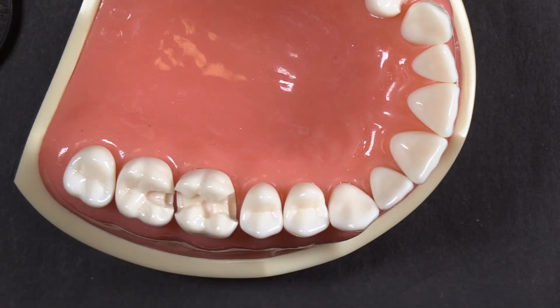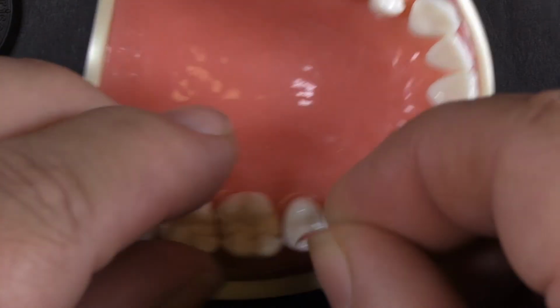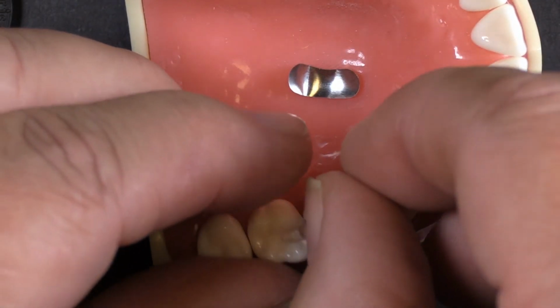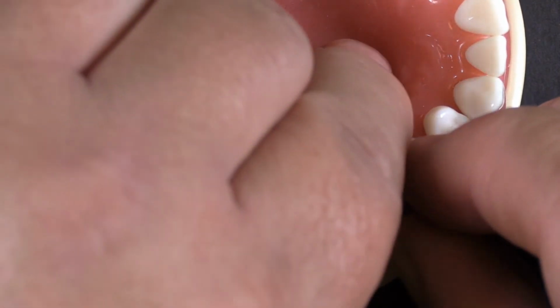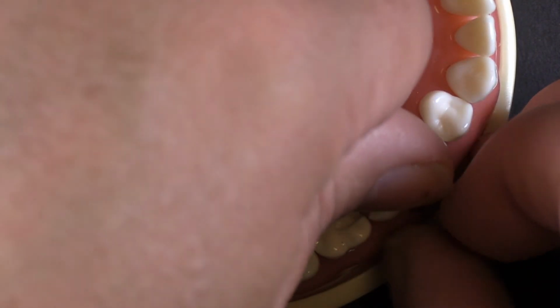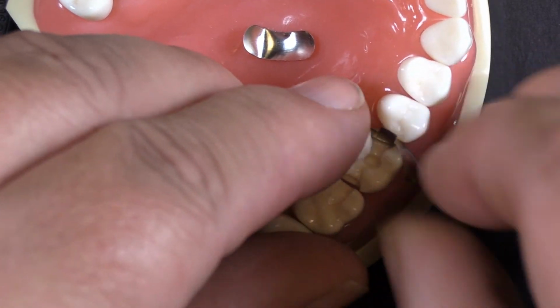So let's throw a band in there quick and show you the right way. I'm going to cheat for time constraints here and try to do this quickly with my fingers so we can get on to our next question. Alright, there is a band.